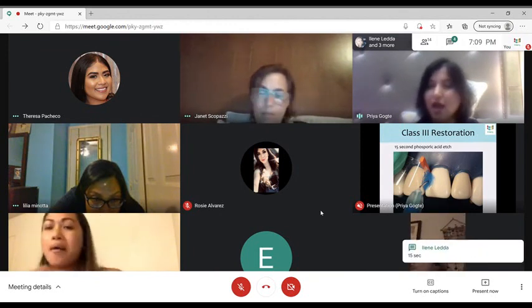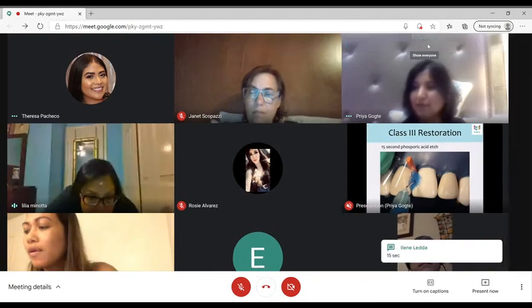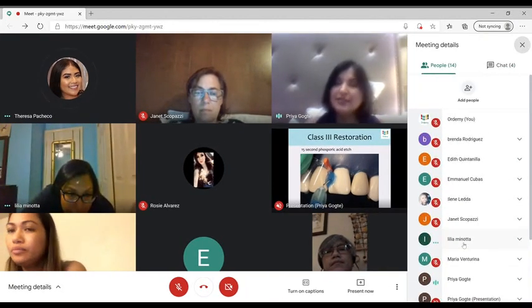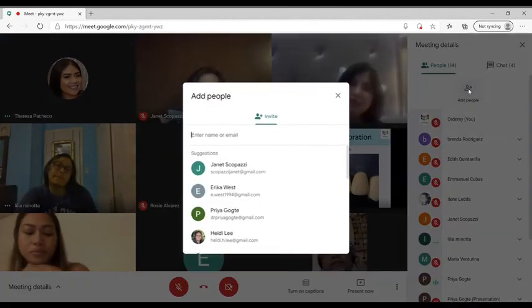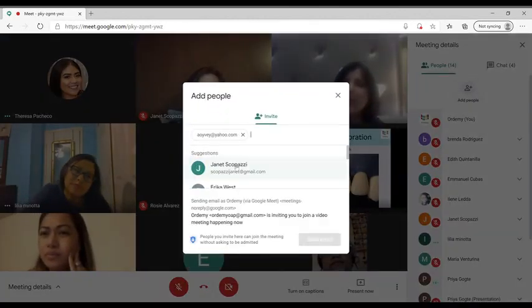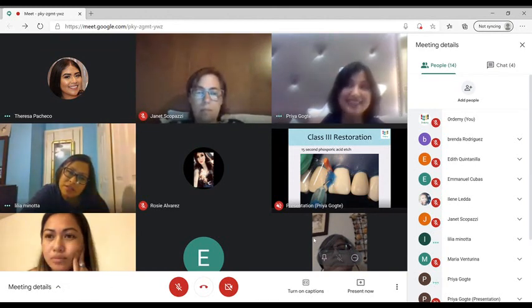And then after that, what do you do? You air dry it, you rinse it. Rinse it with water. Sometimes I've seen some of my assistants just quickly rinse it. You want to rinse it off for a little bit.